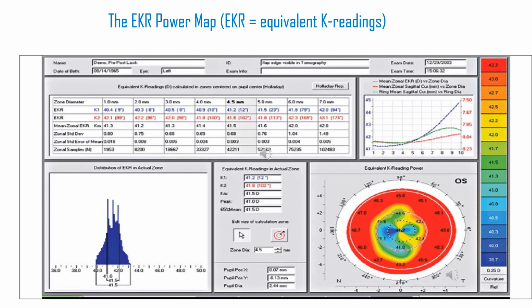Now that it has the right power of the cornea, it then calculates back what the anterior corneal values would be based on the historical corneal index, which all the IOL calculation formulas use, that is 1.3375. I repeat, there are two steps.